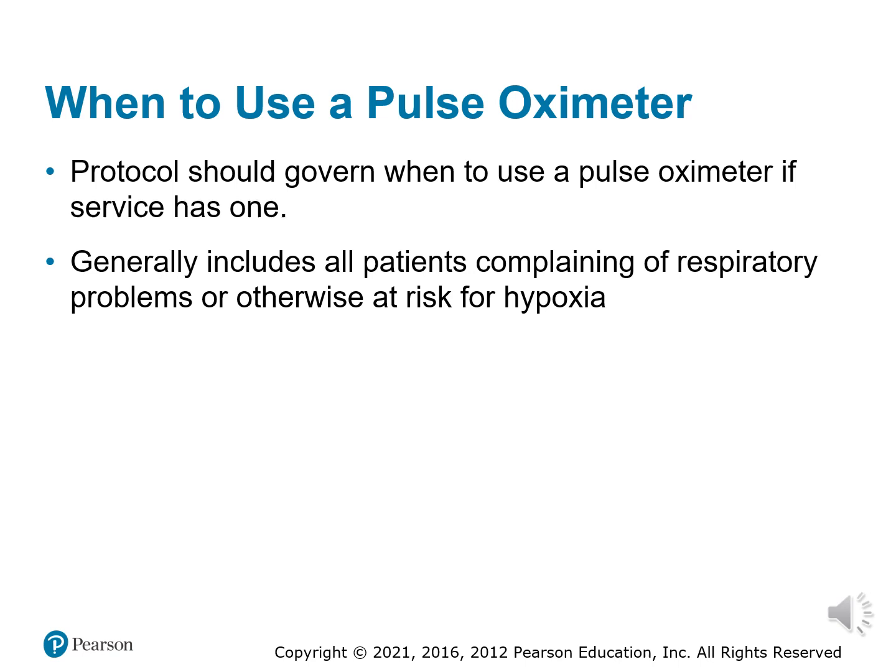And then on that important patient who you may not have put that pulse ox on, maybe their O2 sat is only at 82%, and really the only thing you have to do is give them oxygen. So I highly recommend, from my own personal opinion, putting it on every single patient. However, make sure you check your protocols and make sure that that's okay to do as well.